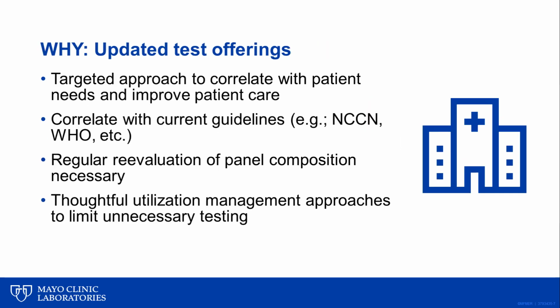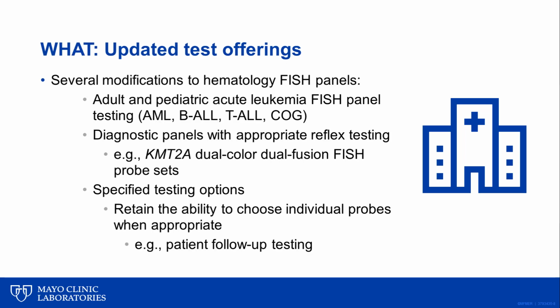In addition to the billing and tube type updates, there are some exciting changes coming to our hematology FISH menu. These changes were implemented to provide a targeted approach to correlate with patient needs and improve patient care, and to correlate with current guidelines, including NCCN and WHO. By taking the time and effort to evaluate and update the probe composition of our FISH panel offerings, we were able to thoughtfully consider utilization management and limit unnecessary testing. Several changes to our hematology FISH menu have been made, and I encourage you to review at your leisure.